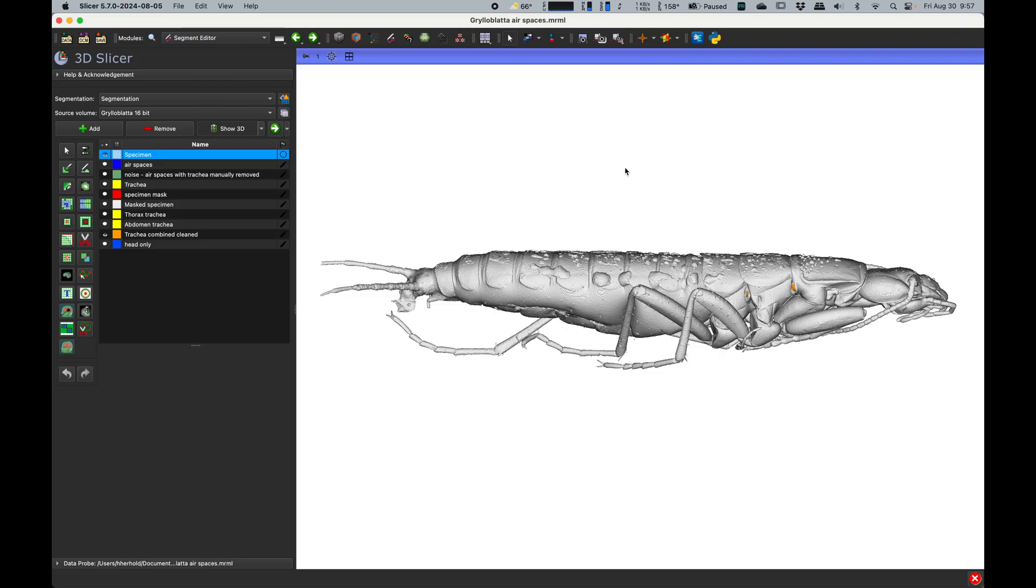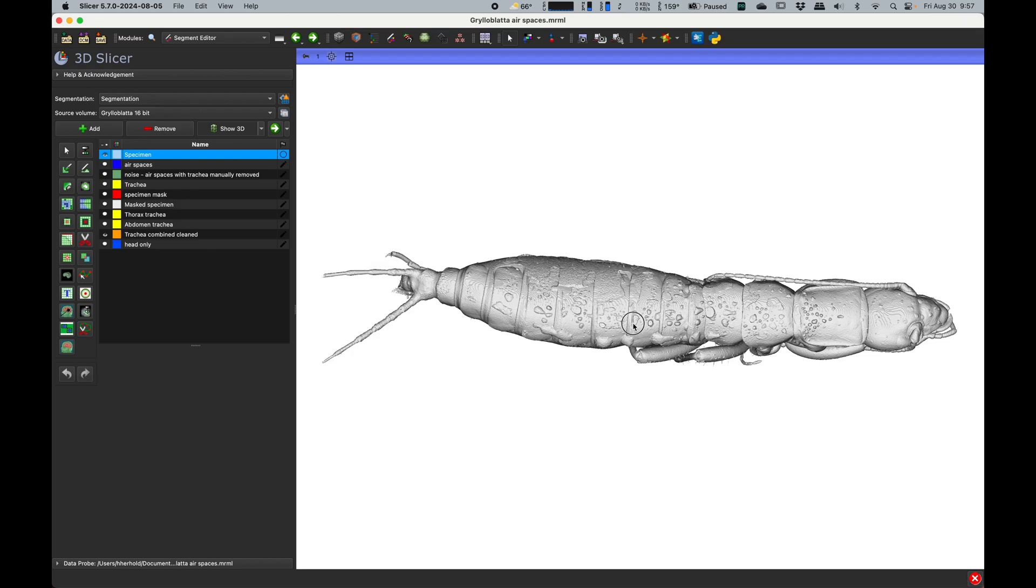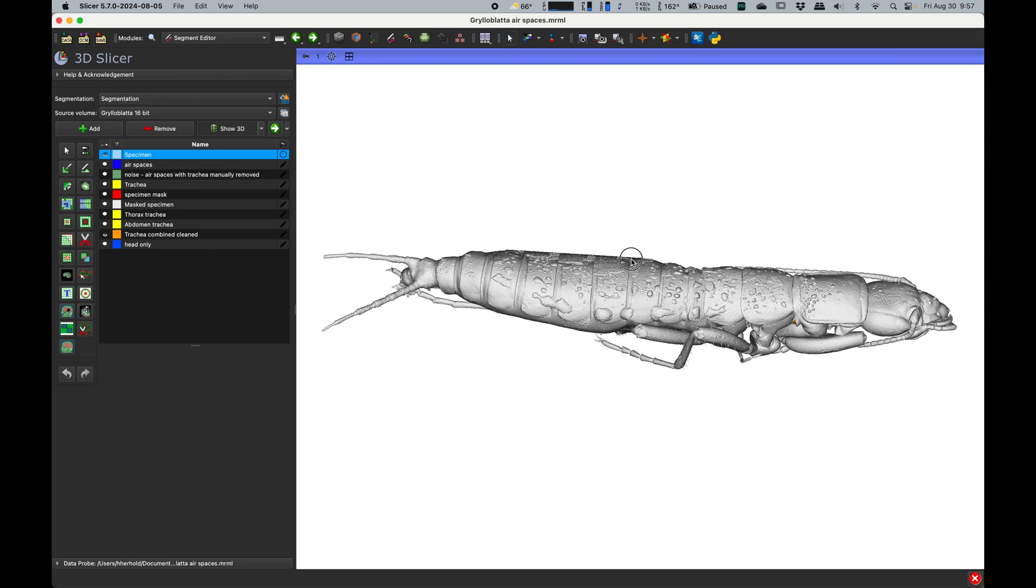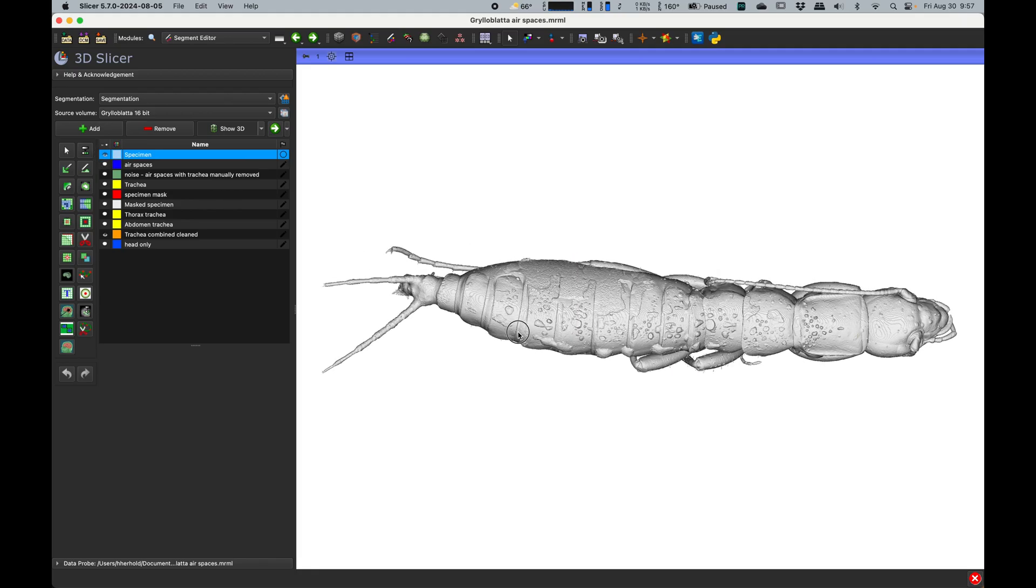So here we are in Slicer with our ice crawler model that I showed in previous videos. These are cool little insects that live in the ice pack up in the Rockies and places like that. So what we do is we go to the segmentations module.